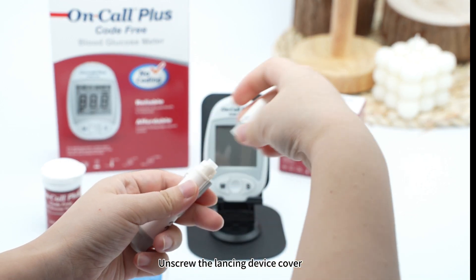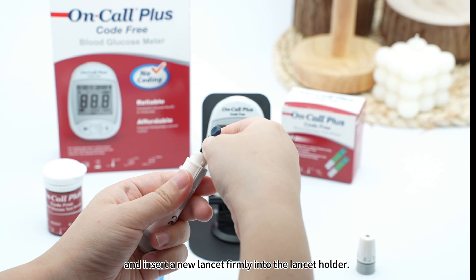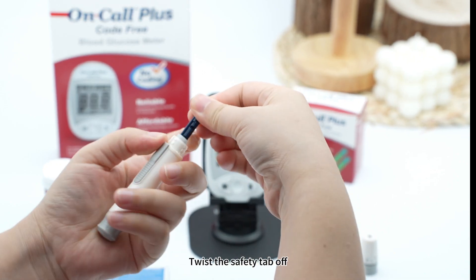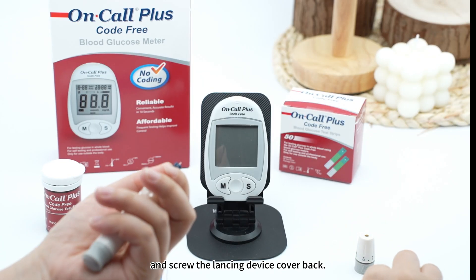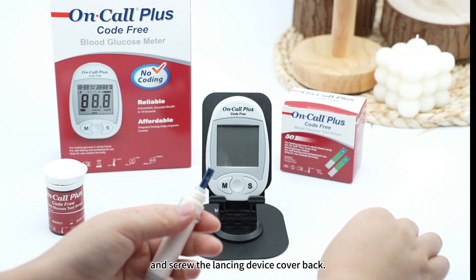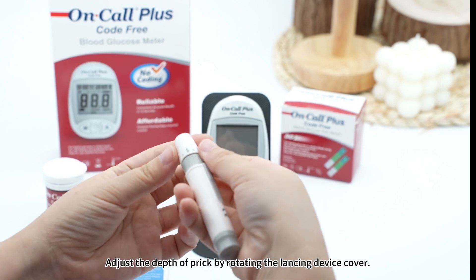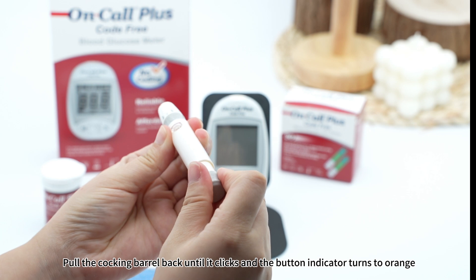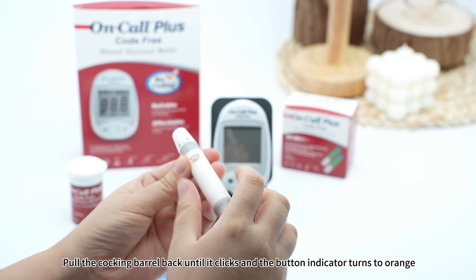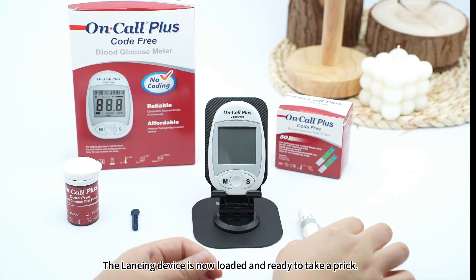Unscrew the lancing device cover and insert a new lancet firmly into the lancet holder. Twist the safety tab off and screw the lancing device cover back. Adjust the depth of prick by rotating the lancing device cover. Pull the cocking barrel back until it clicks and the button indicator turns to orange. The lancing device is now loaded and ready to take a prick.